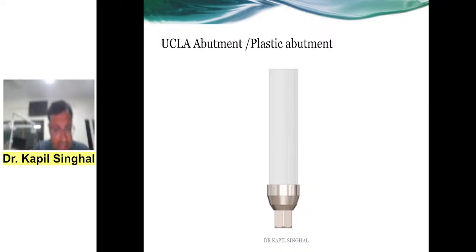What is this? This is a UCLA. It was found in University of California. UCLA, or a plastic abutment, or a castable abutment. Is it clear? Now, in this, you can see this part is entirely plastic.